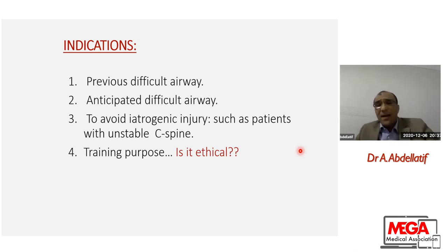And I think one of the most important indications for us is the training purpose, because I have to train on easy patients so that I will be ready in a case of difficult airway.